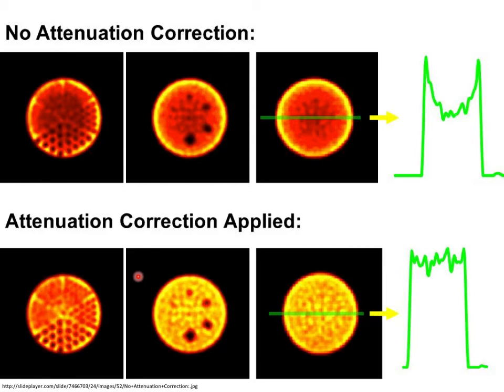That's a terrible explanation, but we'll look at it in more detail when we look at the Fourier transform. The other thing that occurs in SPECT when you're doing reconstruction is that if you don't correct for the attenuation of the object itself, you will observe fewer events in the center versus the edge of the object, because the events in the center have to pass through more object to get to the detector. So there's a higher probability they will be absorbed, the photons coming from the middle.